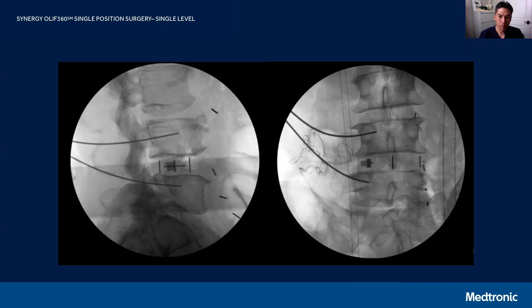In this case at L4-5, we place wires at L4 and L5, then come to the front of the patient to do the disc preparation. I used a PIVX implant — in this case a 27-millimeter cage — as this patient had good, large anatomy. After placing the PIVX cage, you come back to the posterior aspect and place your final pedicle screws and rods. The reason you cannulate the pedicles first is that once you do disc preparation, dilate the disc, and place trials and an implant, it distracts the disc and alters your anatomy. You must cannulate pedicles before any interbody work because that's when navigation is still accurate — as soon as interbody work is done, navigation is no longer reliable.